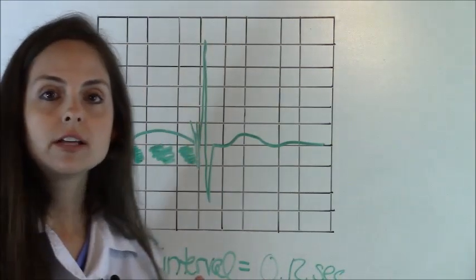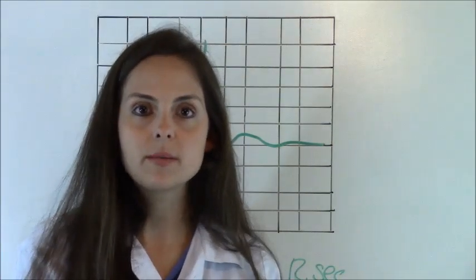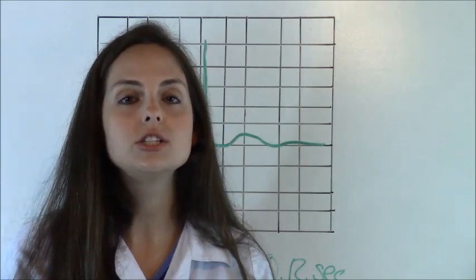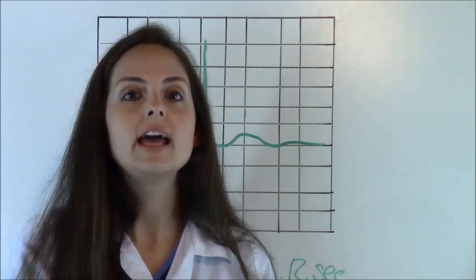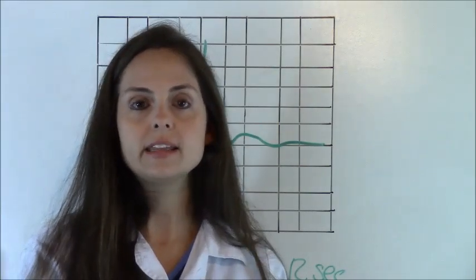And this PR interval is normal. Because remember, any PR interval between 0.12 to 0.20 is normal. Anything over that, you may have a heart block. So that is how you measure the PR interval.